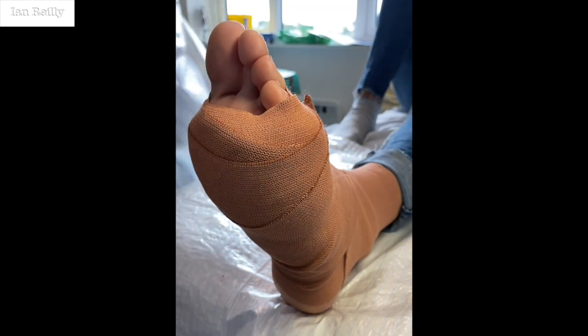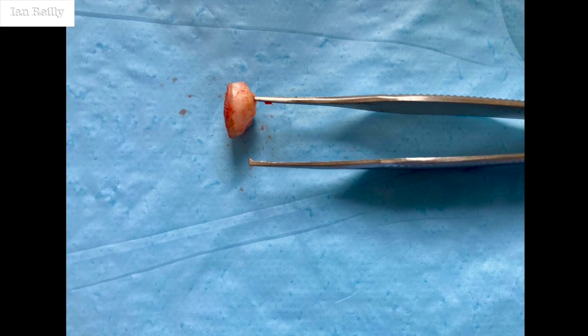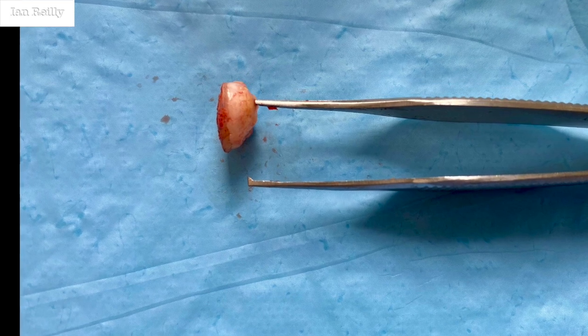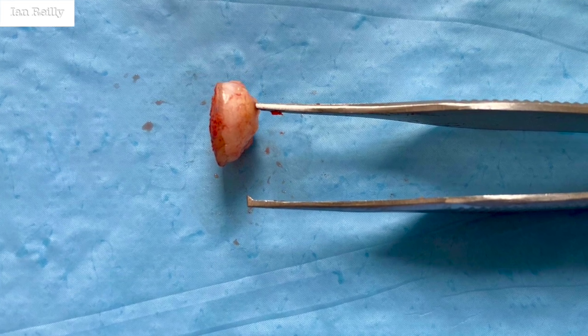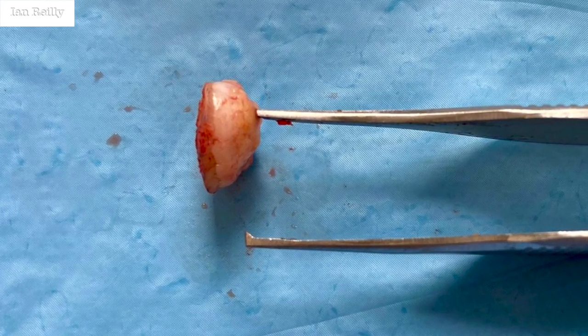You were fabulous — sorry about the shots. You can get some bleeding with these since you've got an open secondary intention wound, so a big dressing, and I often use a post-op shoe to let the patient ambulate. Here's a close-up of the lesion — if you look at the left of it you can see the epidermis, but it's really like an iceberg: all the white fibrous thickened tissue you don't see below, and that's really one of the reasons topical treatments often fail. That went off to histo — came back as a verruca. No surprise there. I will do a follow-up video in a few months when you can see what the overall scar looks like.